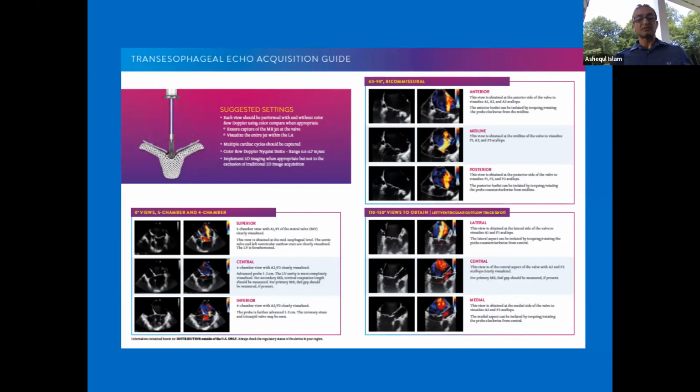Not everybody can do this effectively and efficiently. We have to have the same sort of language during the procedure. One of my colleagues at Bay State often does it with us. There are two other colleagues who are also trained, but definitely not everybody can do mitral clip TEEs.